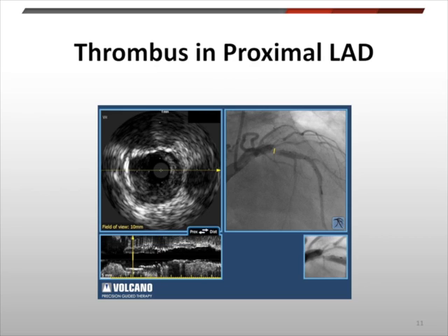Here, where we see the large lucency on the angiogram, it also shows a nice co-registration with IVUS. You can actually see a fairly large thrombus burden sitting at 7 to 8 o'clock, and a small septal perforator located at 3 o'clock. So very, very nice image as well.